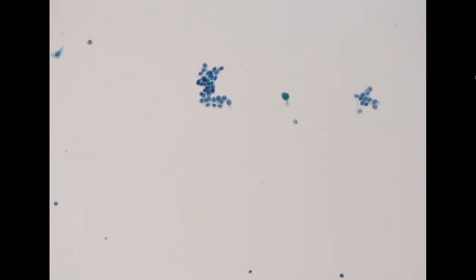So this is positive for PTC. We will sign this out as TBS category 6, positive for papillary thyroid carcinoma. We also see multinucleated giant cells, which are also common in PTC. So this is positive for papillary thyroid carcinoma.